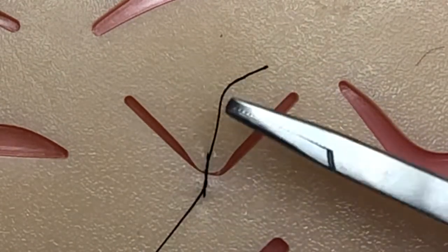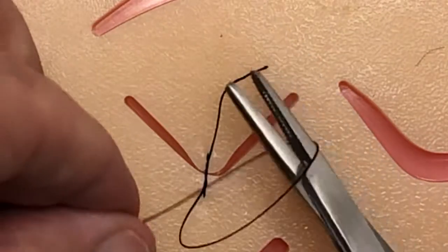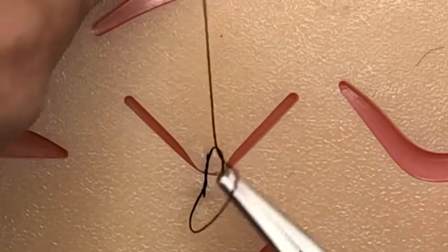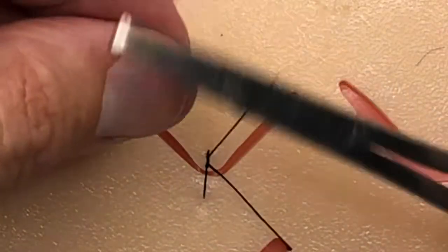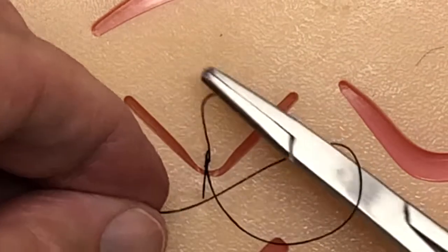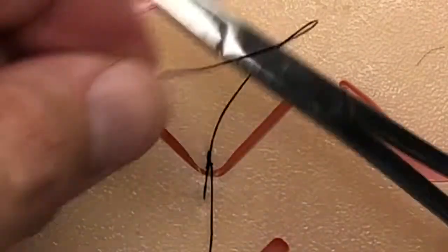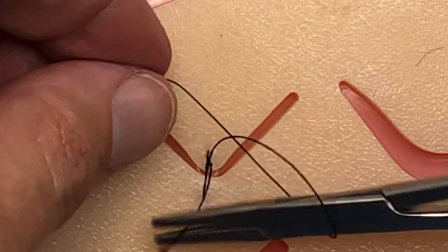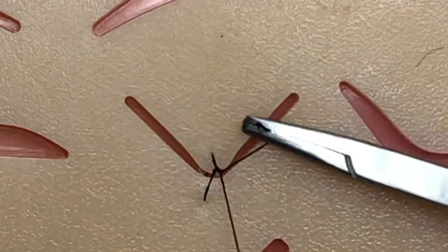And then you come back in, you grab the needle—I'm sorry, the thread—and you're going in opposite directions each time. Opposite directions, three, four, or five throws. All right, so that's a good way to secure that V-shaped flap down whenever you're working with one of these types of lacerations.